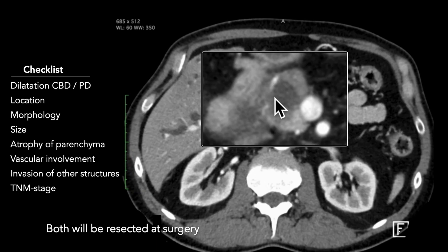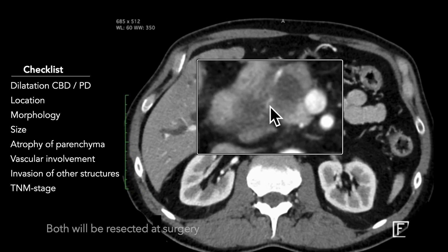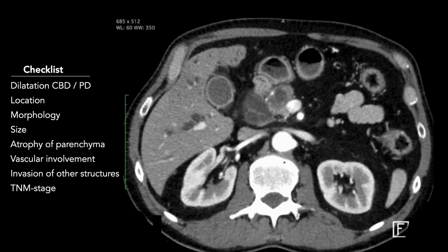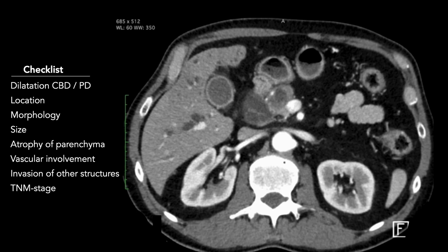There is probable invasion of the duodenum at this point, but no invasion of other organs. Looking at the T-stage, this is a T-2 tumor based on its size of 27 millimeters. Contact with the SMV is over 90 degrees but less than 180 degrees. Depending on the resectability criteria used at your institution, this would either be a resectable or borderline resectable lesion, but there are no signs of clear invasion — still a T-2 tumor, not T-4.